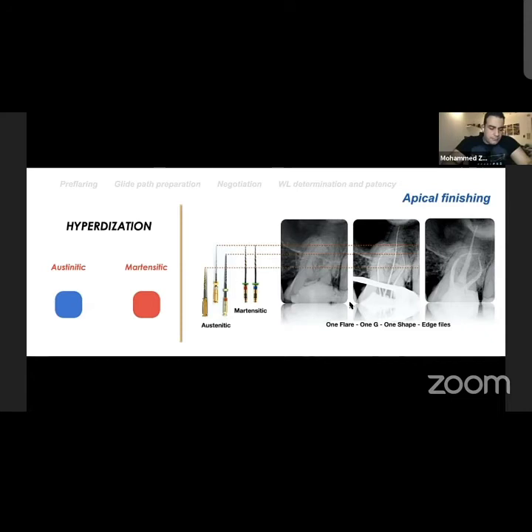No, with watch wind and the pull motion is a question. When you watch wind and pull, it is a pressureless technique as well. It is gentle application, or gentle introduction of the file to the apex, or more apically. We need a gentle motion or gentle force.